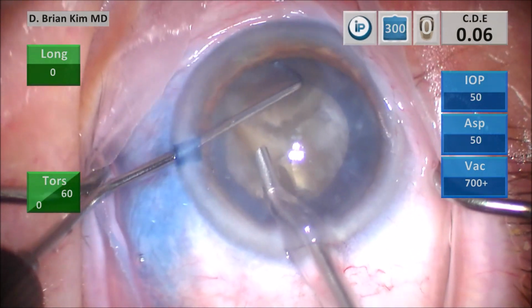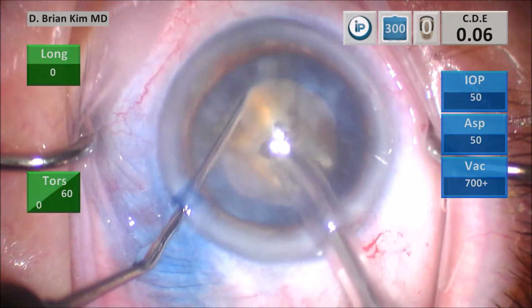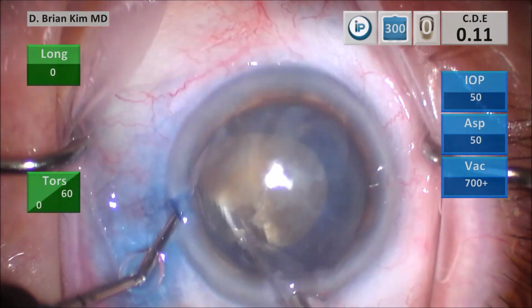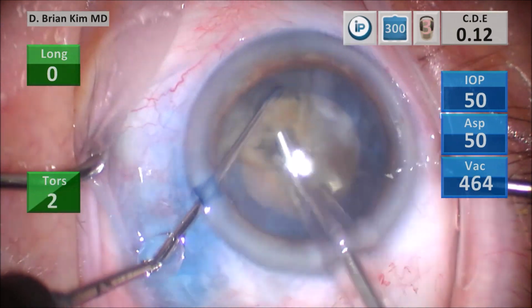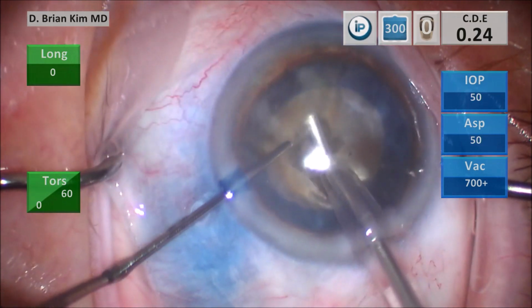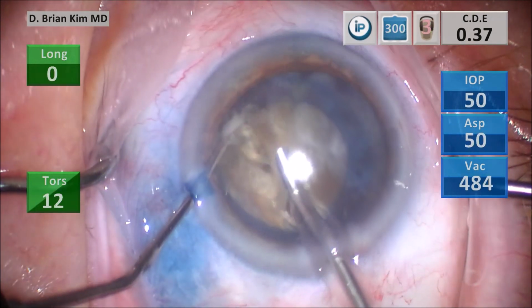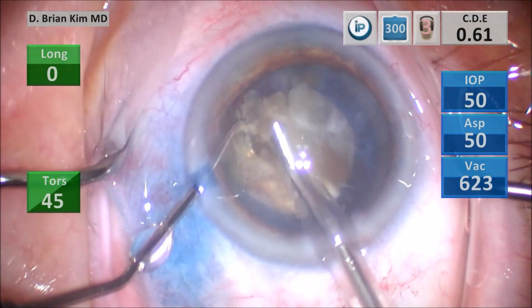I place the chopper around the first quadrant, pulling it centrally towards the phaco tip, and then trying to separate the lens pieces by cracking them, going back and trying to perform successive chop maneuvers here. Lifting that one fragment up with some vacuum and then chopping it again between the chopper and the phaco tip. Again, there are some posterior adhesions.